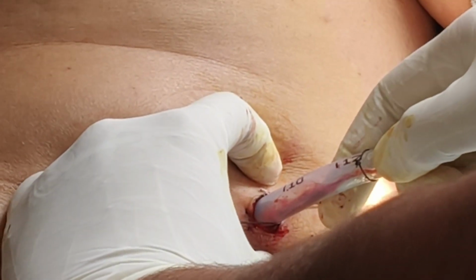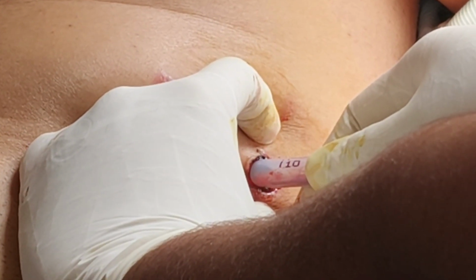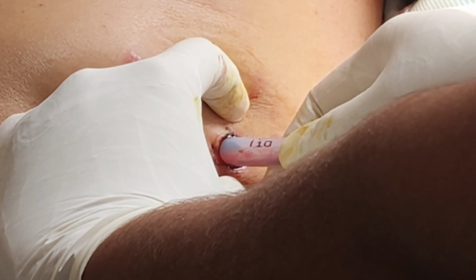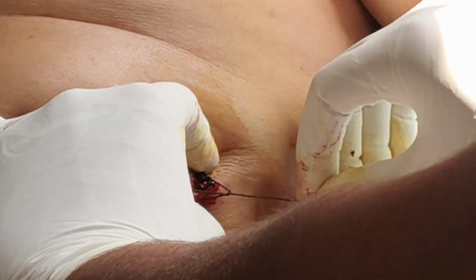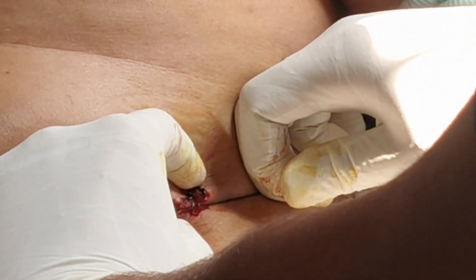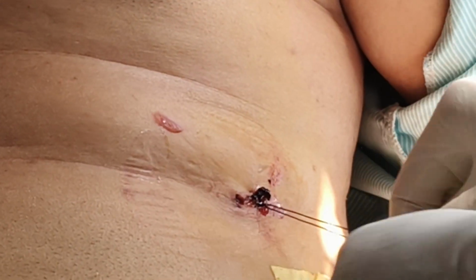Now you have to pinch it. Now you have to tell the patient to take a deep breath in and hold it. Now remove it. I have held it. See, I can hold it any time I want. Okay, the patient is holding the breath. Okay. Release. Now you can tell him to relax. And you can tie it. 4 is enough.